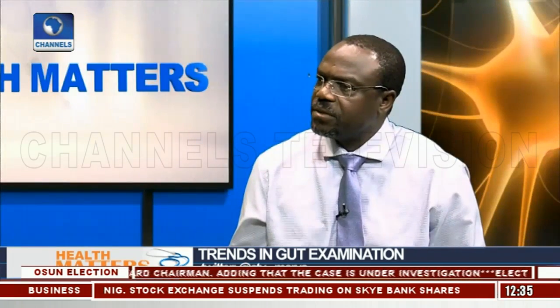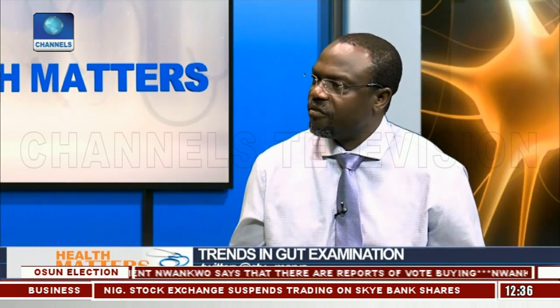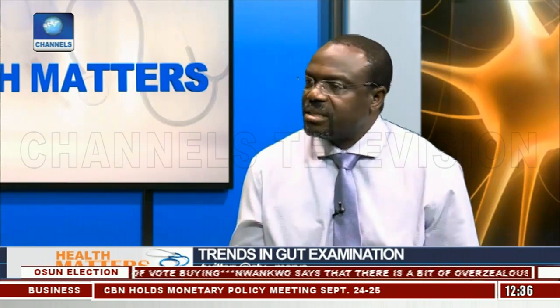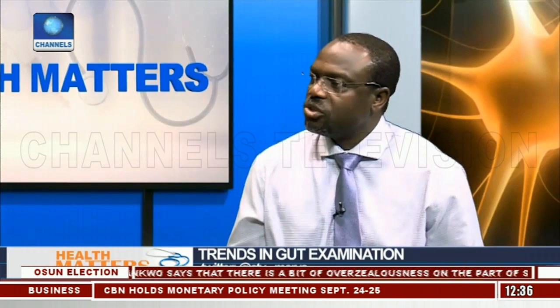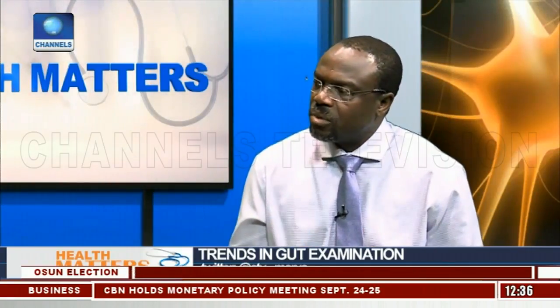Let's start with you describing what an endoscope is. Yes, an endoscope is an instrument that is used to visualize the intestines, and it's basically a camera that is loaded onto a flexible type of telescope, in a simple way of putting it, that is introduced through a natural orifice to visualize the intestine. And nowadays, the image is projected onto a TV screen for better visualization.